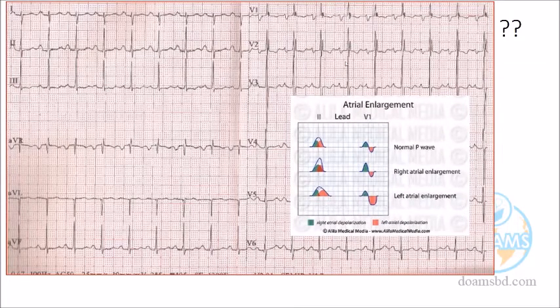Left atrial enlargement. You mean the P mitral? Yes, this is the P mitral. There is a notching of the P wave. So if it is so, this is left atrial enlargement. Thank you, Dr. Ibrahim. Feel encouraged to talk, doctor. Don't be silent.